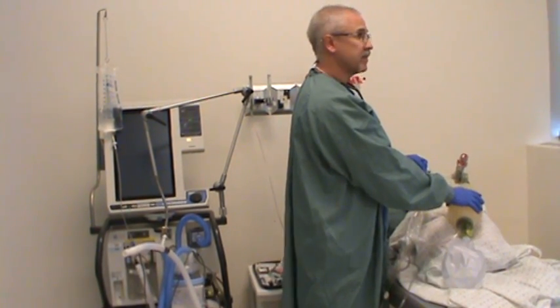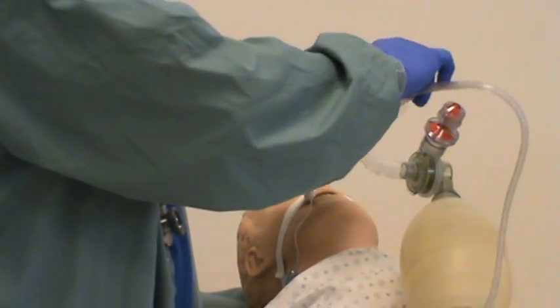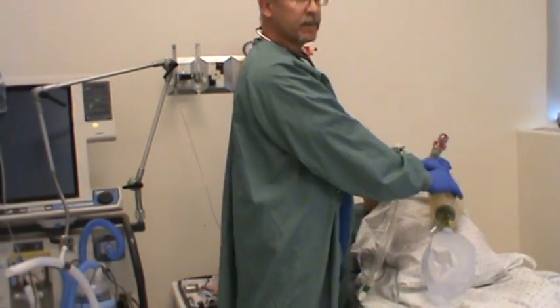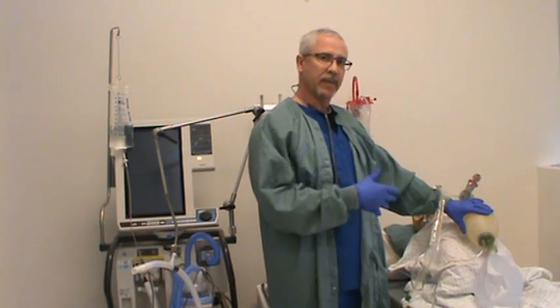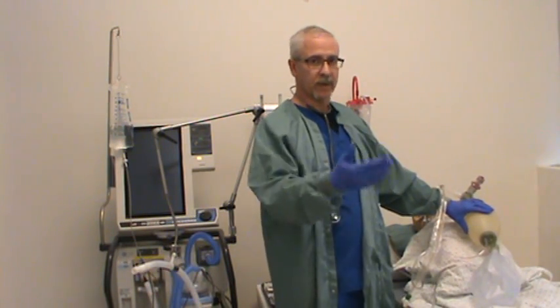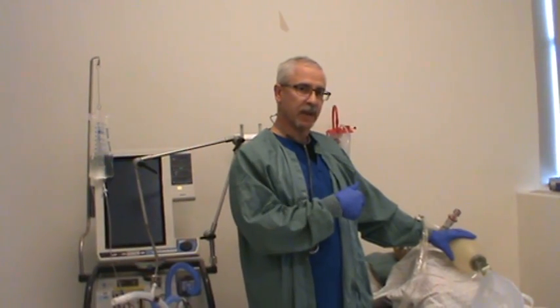One to two minutes have passed since the last suctioning. Check the vital signs on the monitor — they are in fact normal. Now suction the patient out again: stabilize the tube, grab the plastic sheathing, advance the catheter in, hit the restriction, pull back, apply suction, then resume ventilation. Check that their vital signs stabilize and listen to their chest. At this point my patient has been suctioned out twice, all secretions removed. Note the amount and color of secretions and restore ventilation status. Continue in this fashion until the patient is established on a mechanical ventilator, taken to transport, or whatever the resolution is.